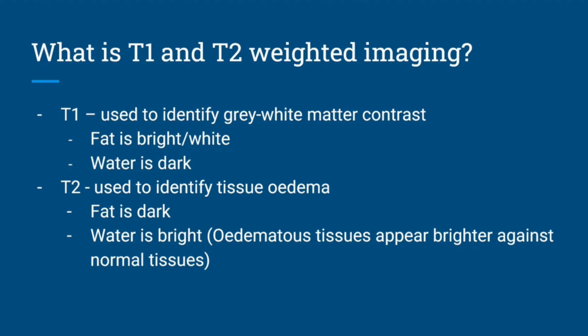Arnold Schwarzenegger is good, so it's on the white, so that's how I remember that. Hopefully that's right, but it's to do with what it's measuring. I remember learning this, but I've forgotten. It's to do with the way it comes back and the type of decay that you're measuring. If one is T1 and one is T2, but I can't remember the specifics of it.